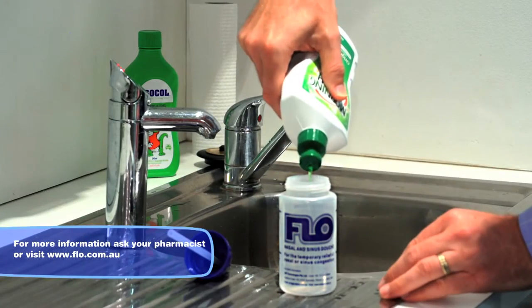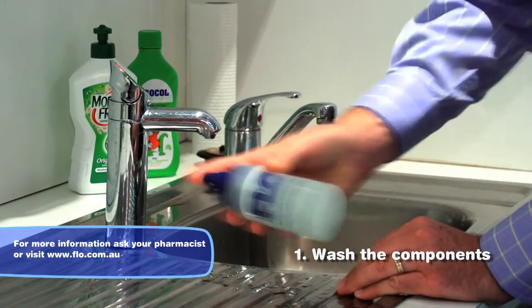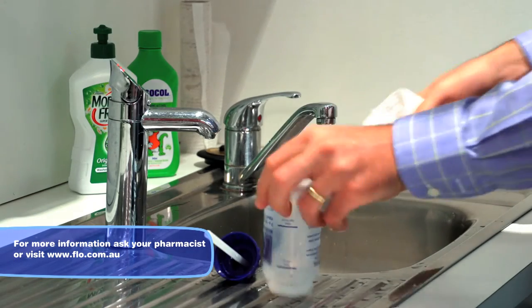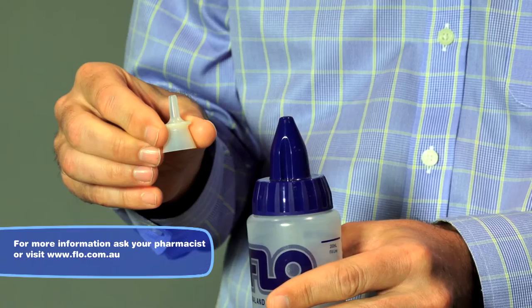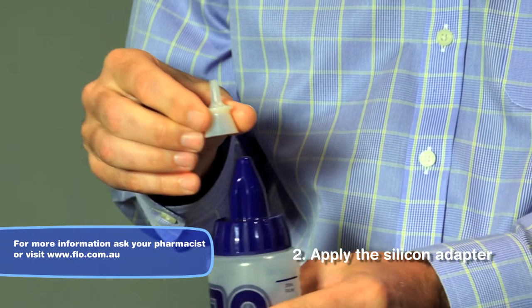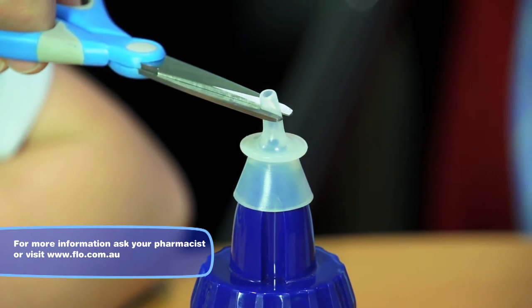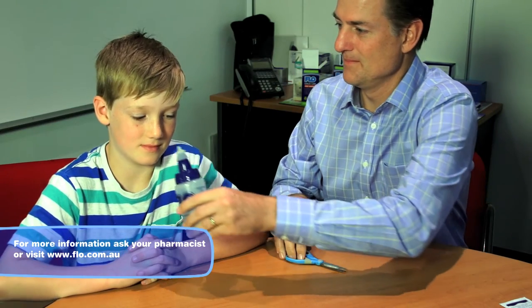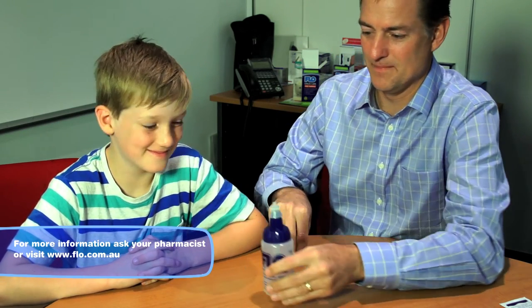You should firstly wash the bottle and all of the components in warm soapy water. Rinse everything well and then dry with a paper towel. If you're using this sinus irrigation with children, then apply the silicon adapter to the top of the nozzle and trim the silicon tip so that it fits your child's nose comfortably. You'll know when you have the right fit when the rim of the base of the nozzle makes a good comfy seal with your child's nostril.